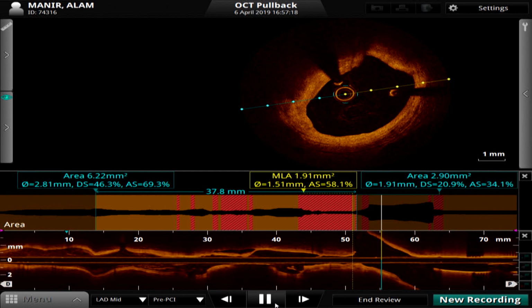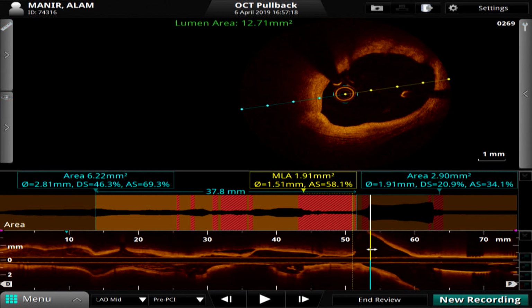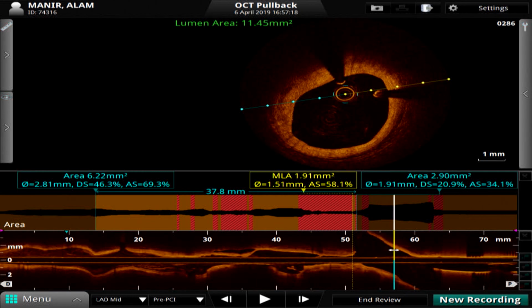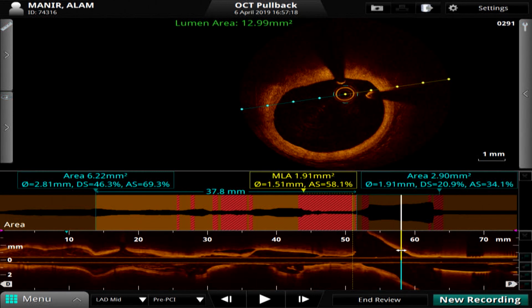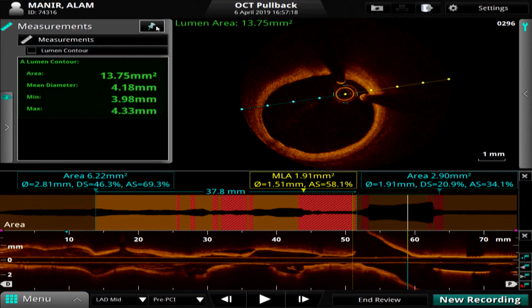You can see that in this particular case, the left main is not normal, but there isn't really any significant disease in the left main that requires us to necessarily extend the stent into the left main. So the plan is V-stenting, which looks like it will be okay for this case. Normally I don't do V-stenting, but here the angle is such, and the disease in both the ramus and LAD suggests that V-stenting will be the good choice.